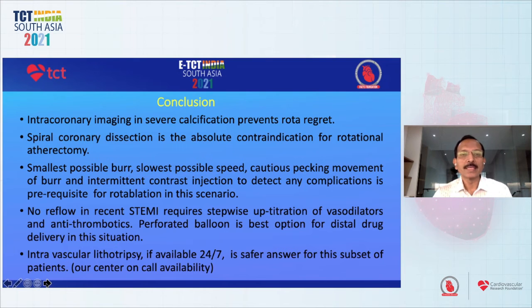No reflow in recent STEMI requires stepwise uptitration of vasodilators and antithrombotics. The perforated balloon is the best option for delivery of vasodilators in this situation. Intravascular lithotripsy, if available 24 by 7, is a safer answer for this kind of problem. However, in our center, it is only on-call availability of this option, which led to rotablation. Thank you very much for your kind attention.